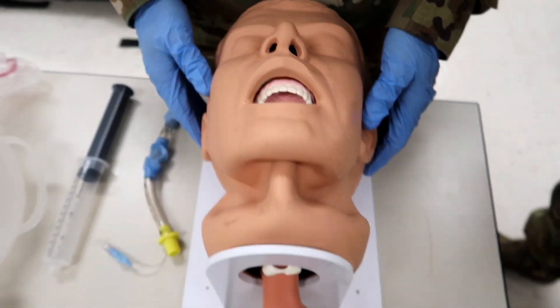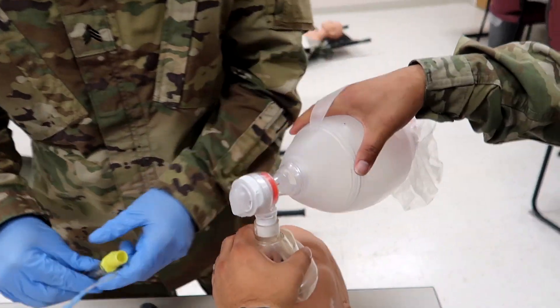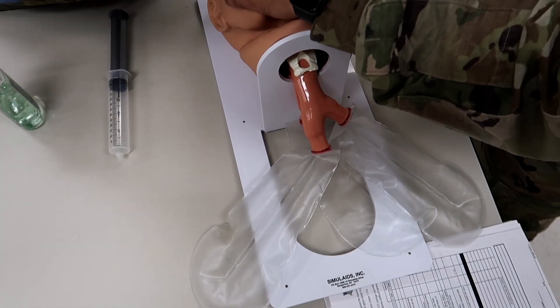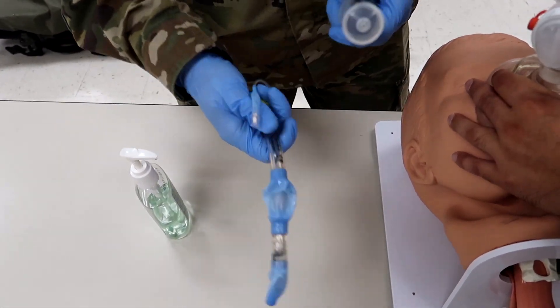Step three: direct assistant to hyperventilate the casualty for 30 seconds. Hyperventilate the casualty for 30 seconds. Now that I've got this, I'm going to go ahead, put it over the nose, get it in the mouth. At this point in time, I'm going to go ahead and prep my equipment. I'm going to make sure that my King LT is lubed up and my syringe is actually functioning properly, as well as my King LT.